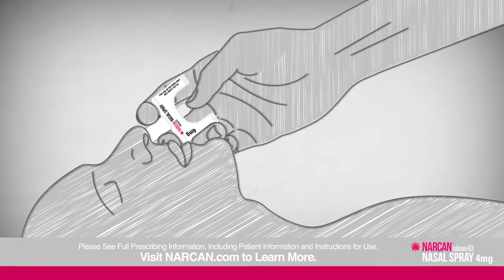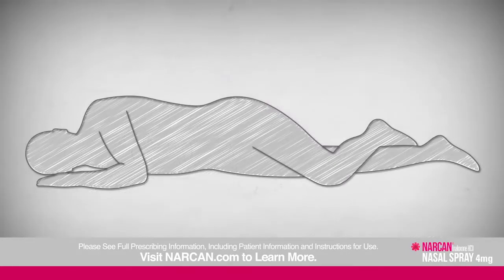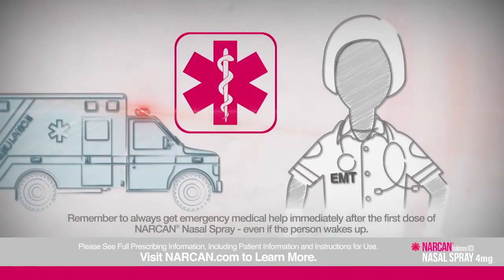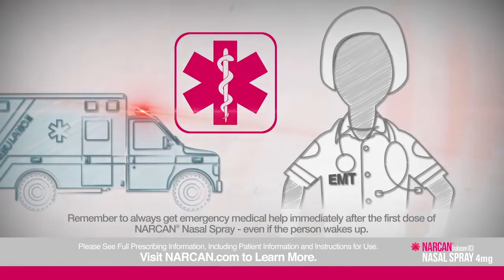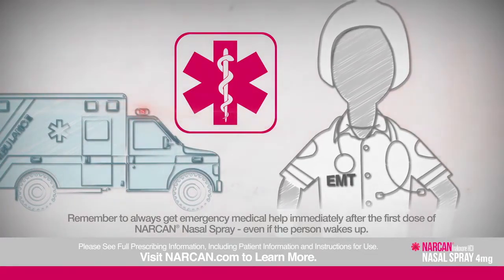Press the plunger firmly to give the dose into the person's nose. After giving the dose, remove the device from the person's nostril and move them on their side, positioning their hands under their head. Call 911 and get emergency medical help right away after giving the first dose of Narcan nasal spray, even if the person wakes up. Narcan is not a substitute for emergency medical care.